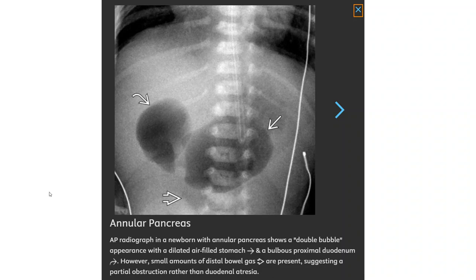This is an AP radiograph in a newborn with annular pancreas, showing a double bubble appearance with a distal air-fluid level — stomach and a bubble in the proximal duodenum. However, small amounts of distal bowel gas are present, suggesting a partial obstruction rather than complete duodenal atresia.